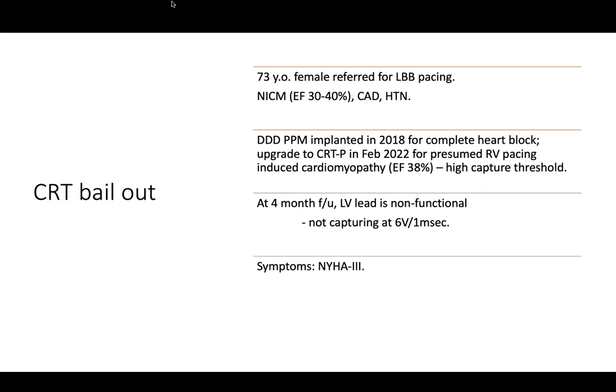What I know is that V4, V3 are useless precordial leads. If you have them on the right side and at different heights, maybe it's going to be more useful, because that's what you're looking at, you know. I don't know. Right.